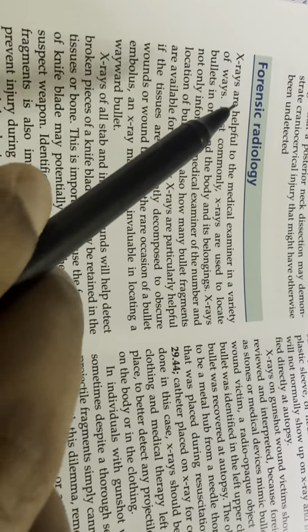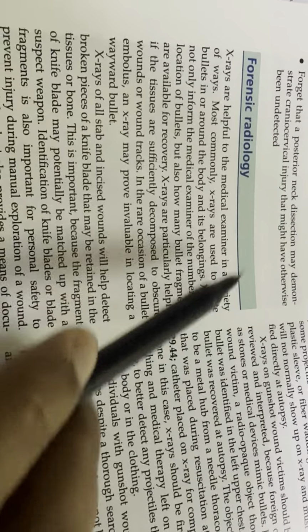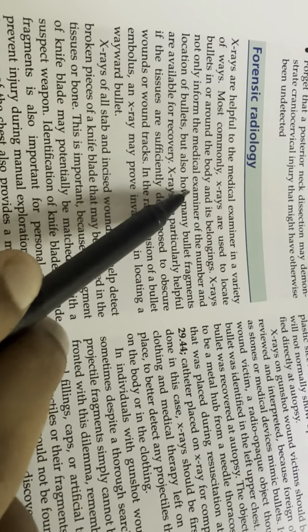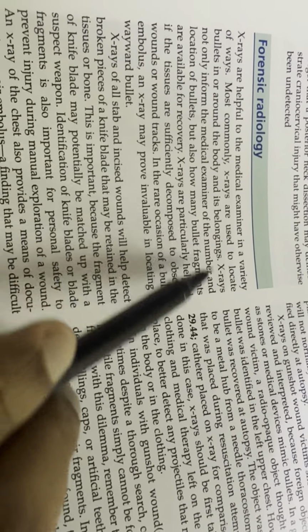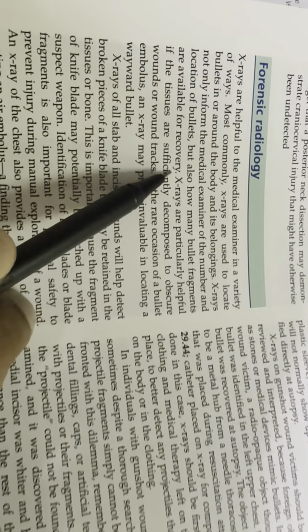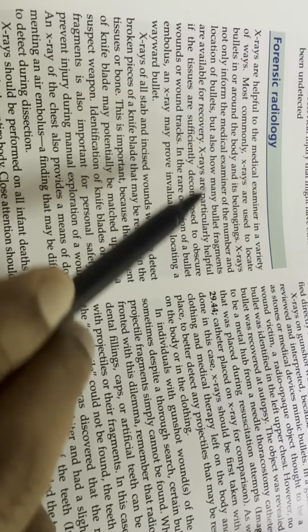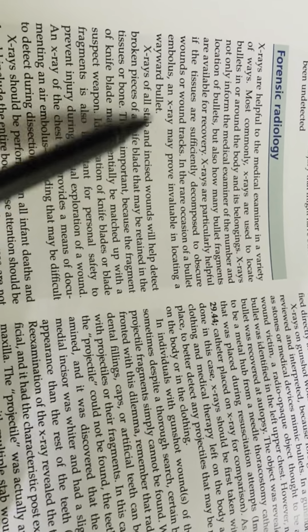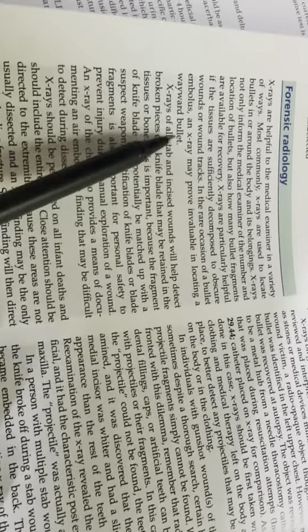Forensic radiology X-rays are helpful to the medical examiner in a variety of ways. Most commonly, X-rays are used to locate bullets in and around the body and its belongings. X-rays not only inform the medical examiner of the number and location of the bullets, but also how many bullet fragments are available for recovery. X-rays are particularly helpful if the tissues are sufficiently decomposed to obscure wounds or wound tracks. On rare occasions, if a bullet embolizes, an X-ray may prove invaluable in locating a wandering bullet.